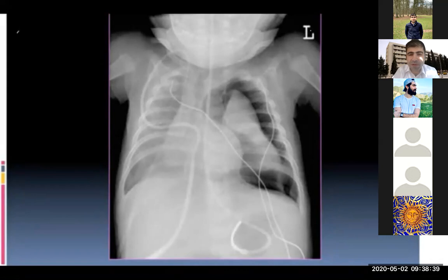Yes, doctor. Okay. Hanin, can you tell me, to make it simple, according to our system, A, B, C, D, E, F, and just go through these. It is not necessary to know the diagnosis, and I can help you with that.